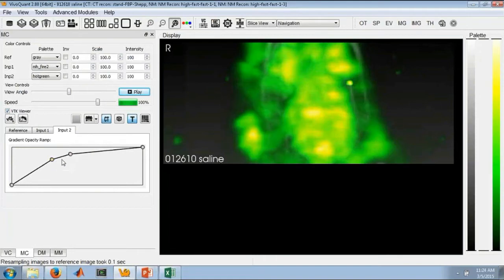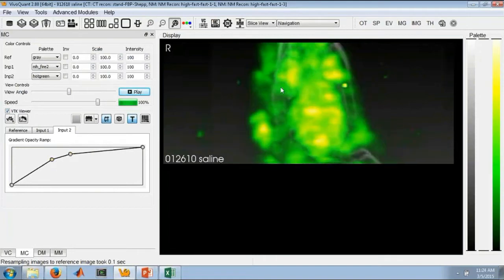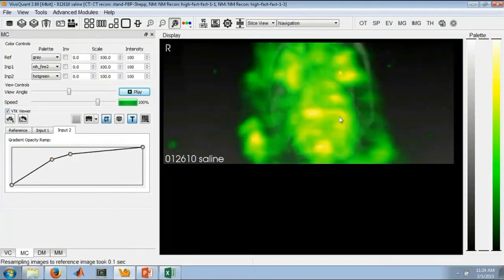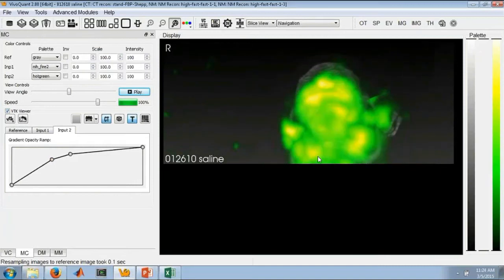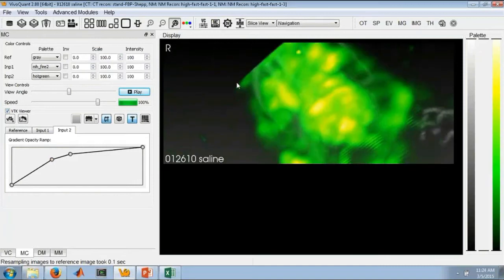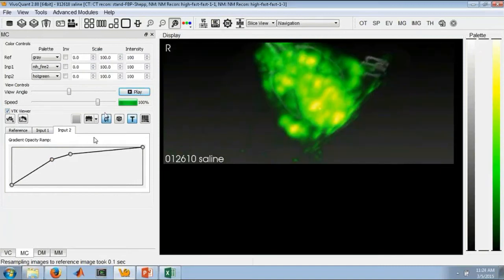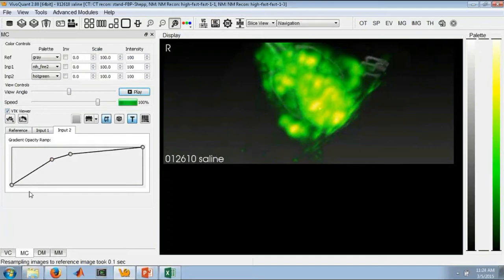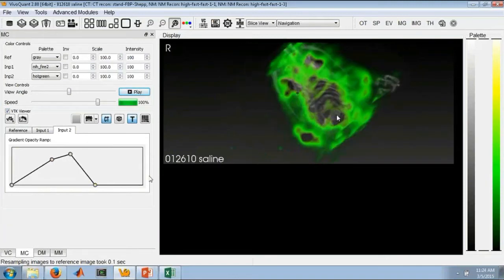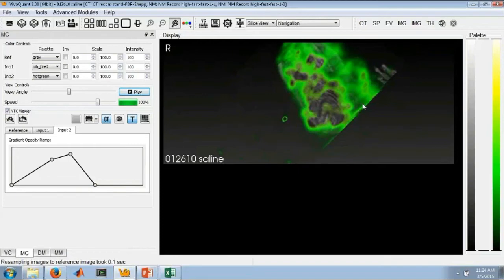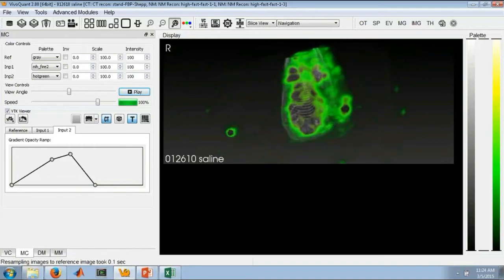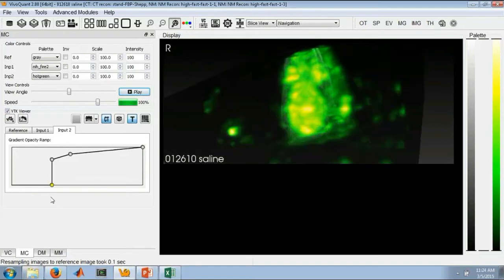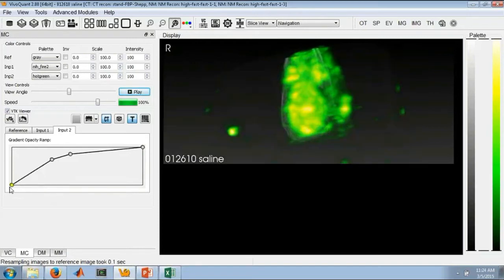What this does is it allows you to use the VTK viewer so you can still zoom out, zoom in, move the data around as you would like, which you can't do in the traditional MIP viewer, but you can also adjust these opacities. The best way to understand this is just think of your histogram along this x-axis here, and then you're just setting which values you wish to show or hide. I can hide the brightest values if I want and look at this strange image here, or I can show just the bright images, doing something like this.